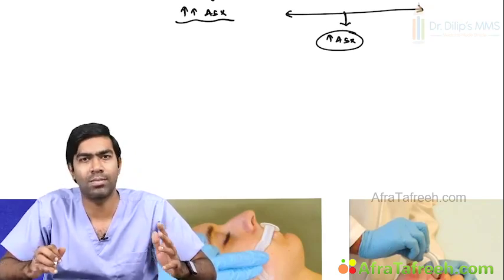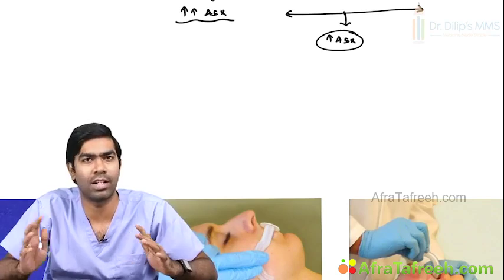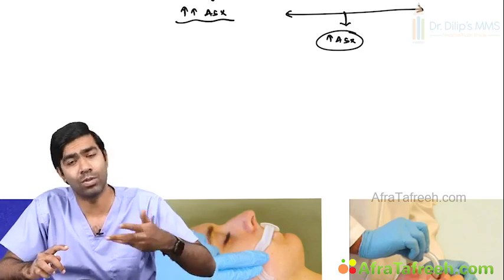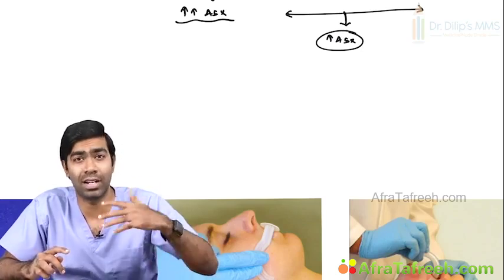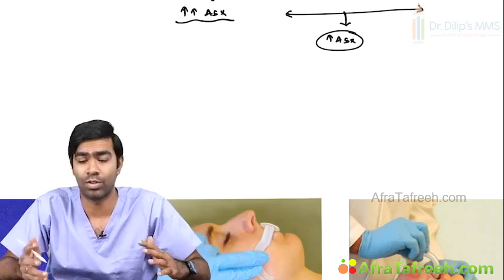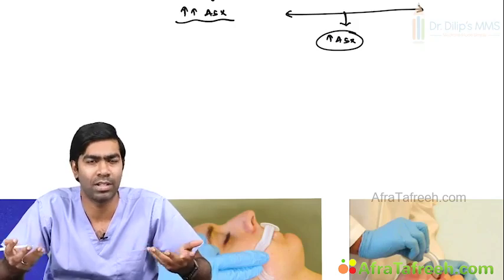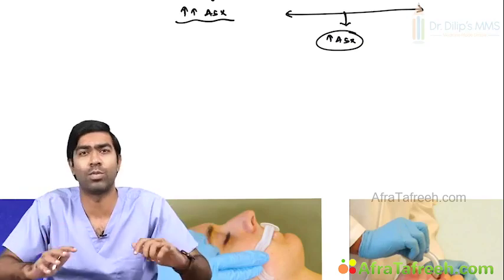At the same time, they come somewhere in between. And nowadays, the laryngeal masks are so advanced. Third generation supraglottic airways have come, like the Baska mask, which itself can be used for anesthesia purposes. It is a replacement for endotracheal intubation. So they are thinking in that big term. So now there are a lot of improvements happening in the supraglottic airways also. Let us see in the next section how big is this world of supraglottic airways.